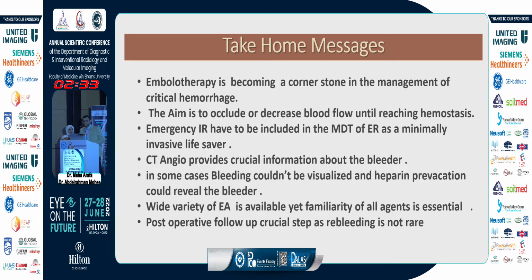So basically, our take-home message for today: embolotherapy is becoming a cornerstone in the management of critical hemorrhage, whether spontaneous, iatrogenic, or even traumatic. The aim is to occlude or decrease blood flow until reaching hemostasis. Emergency interventional radiology has to be included in the multidisciplinary team of the ER as a minimally invasive lifesaver. The last patient had no option except for IR.